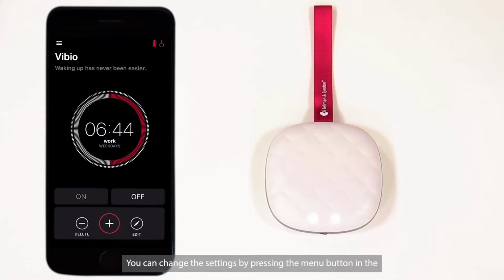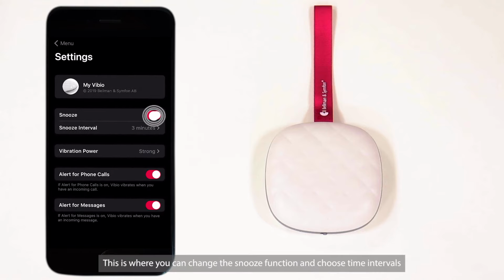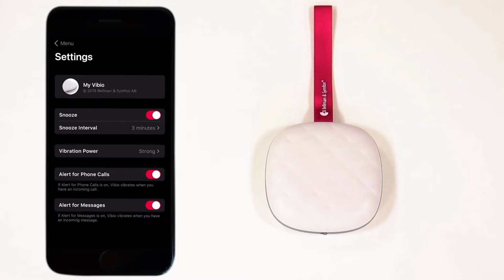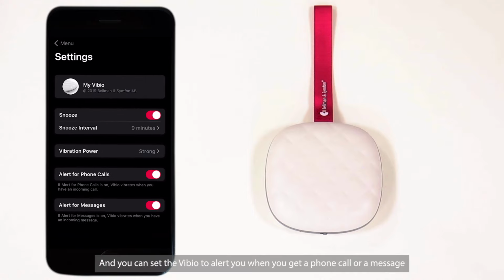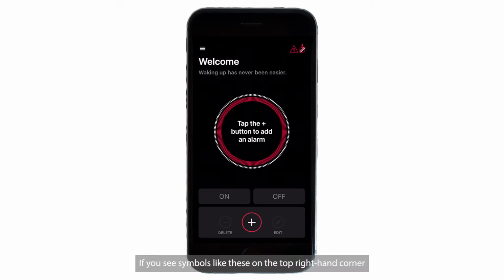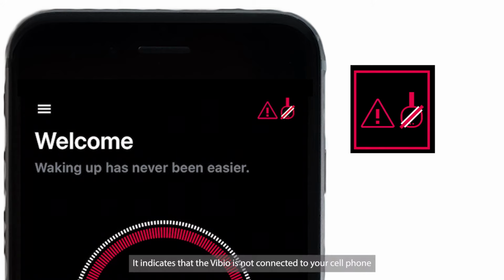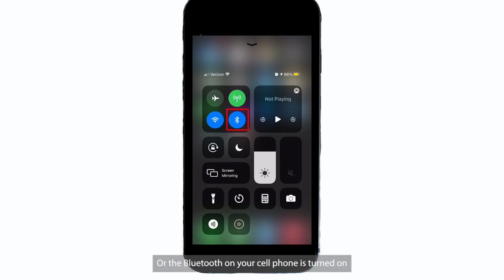You can change the settings by pressing the Menu button in the top left-hand corner. Then press Settings. This is where you can change the snooze function and choose time intervals. You can also change the power of the vibration to soft, medium, and strong. And you can set the Vibio to alert you when you get a phone call or a message. If you see symbols like these in the top right-hand corner, it indicates that the Vibio is not connected to your cell phone. Check if Vibio is turned on, or the Bluetooth on your cell phone is turned on.